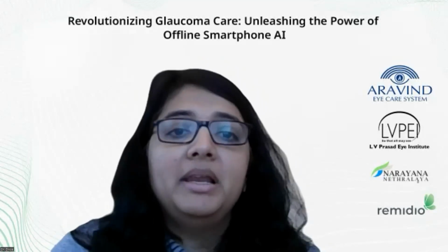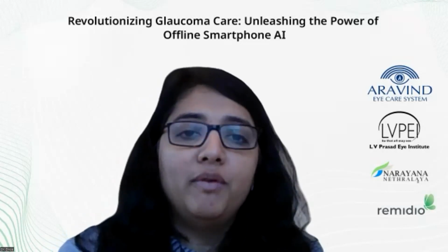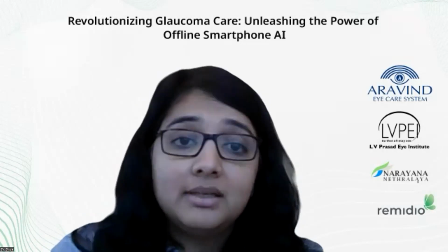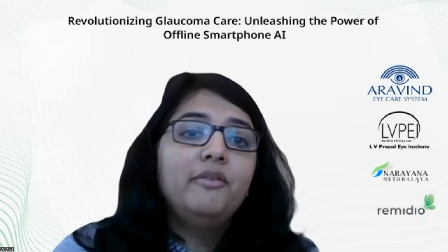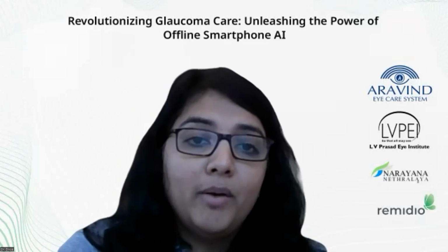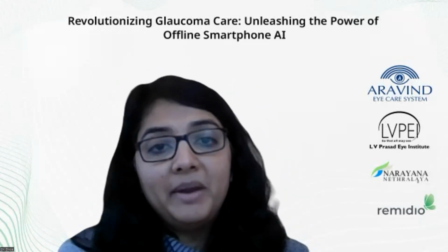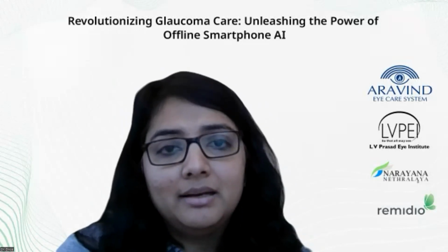So if it is in the population, we know the prevalence of disease is low, so you don't want to be over-referring patients. There, the specificity of the tool needs to be high. If you're using it within the clinic, where you know the caseload of those with glaucoma walking in is high, you want the tool to be more sensitive. So depending on the context, the optimization is dependent.